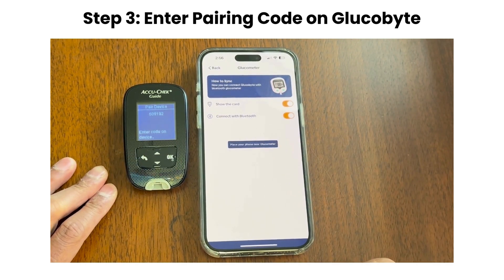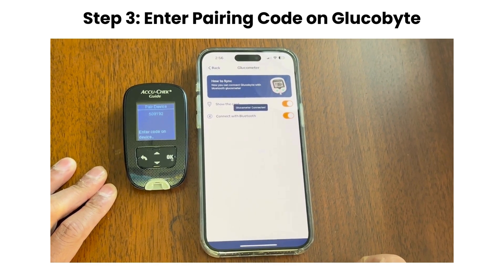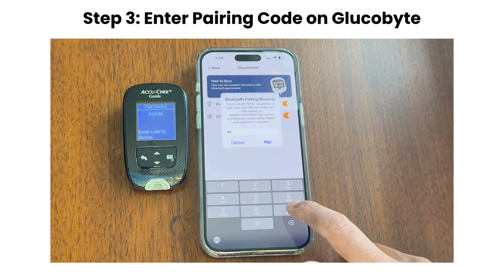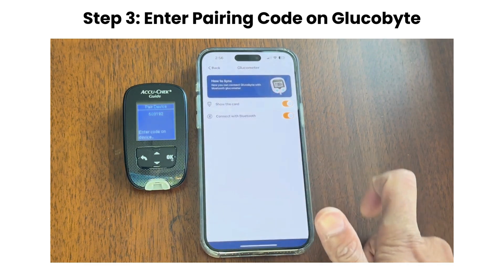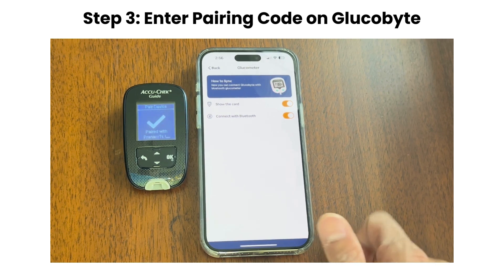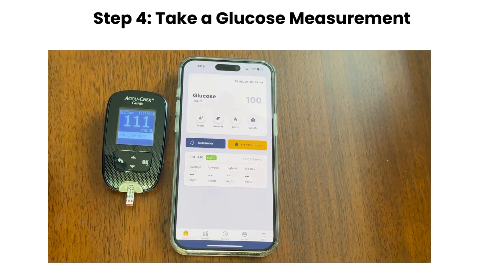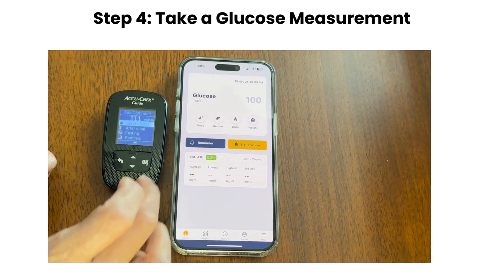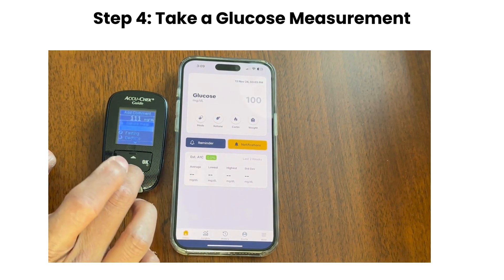You'll see a pairing code on the AccuCheck monitor. When prompted by Glucobyte, enter this code to complete the pairing. You should then see a connection success message on the app. Now take a glucose reading with AccuCheck. The data will automatically sync to Glucobyte, making it easy to track your results.